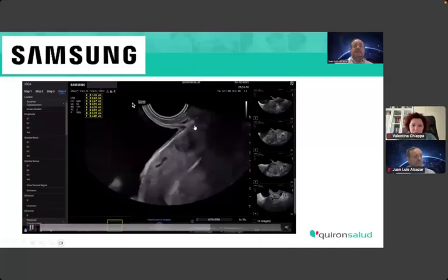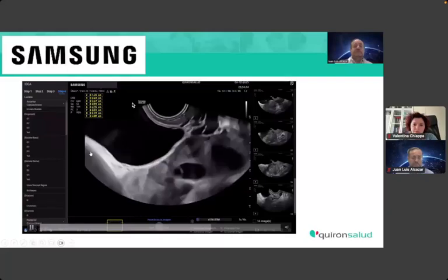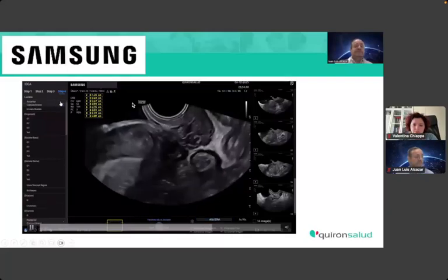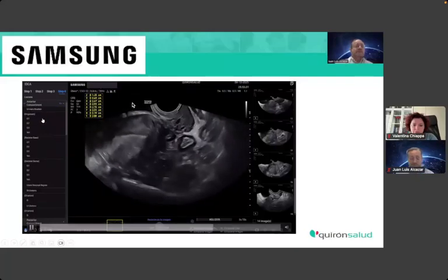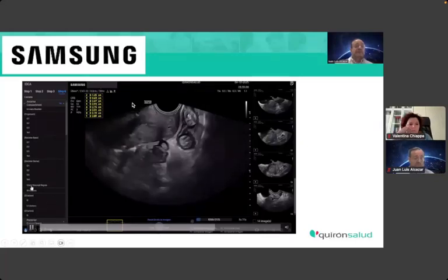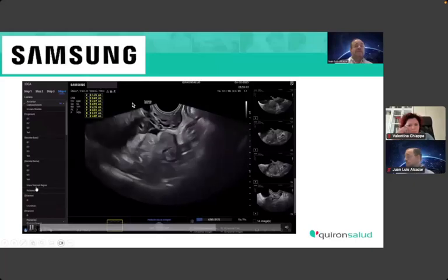Again, reviewing the bladder, the trigonum there, base, and the dome here. And then you mark no in the anterior compartment. So no need to click on trigonum, bladder, base, or dome. The ureters are okay. And also the sliding of the uterovesical region to detect whether this area is obliterated or not.